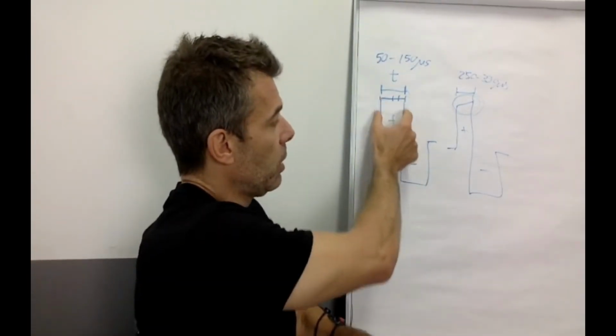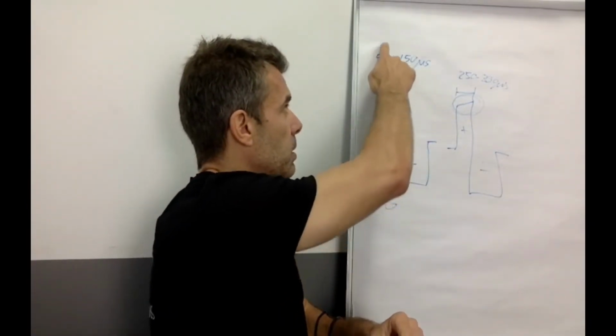And here I'm going to show you how we manage to stimulate. All right, look, I'm going to increase the intensity. I'm increasing, okay? Here is where I start to feel that the TENS is working. With the TENS, you know you feel a tingling sensation, right? So I'm feeling the tingling. Right now, we would be using this pulse width, but if I go further, I'll keep that same pulse width, but I'm increasing the intensity. In the end, I would reach a current level that would stimulate the alpha motor neuron, and I'm going to show you that. Here, the muscle is relaxed, but I'm feeling the tingling. I'm at the right intensity. If I keep increasing, look at how the muscle contracts, okay?